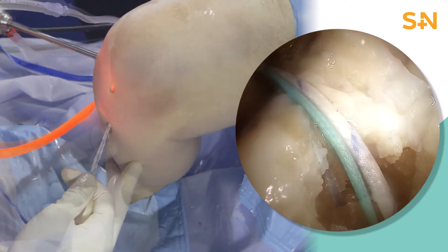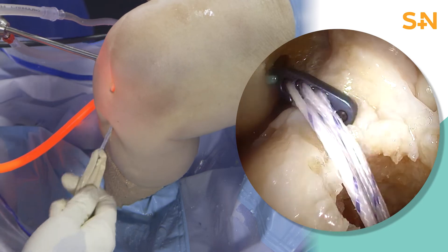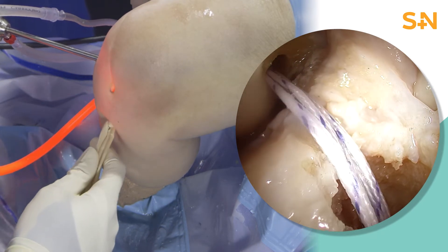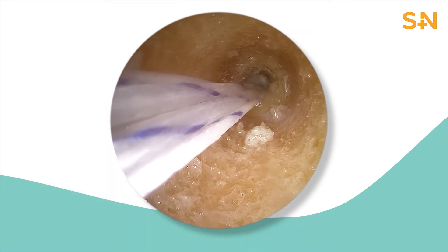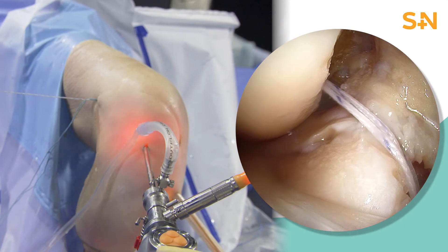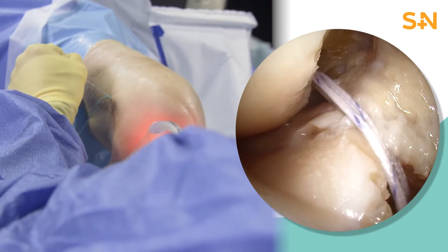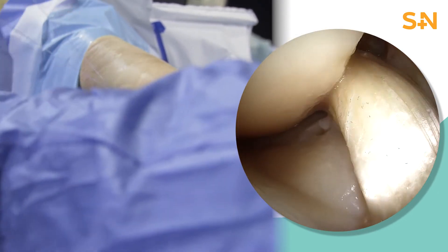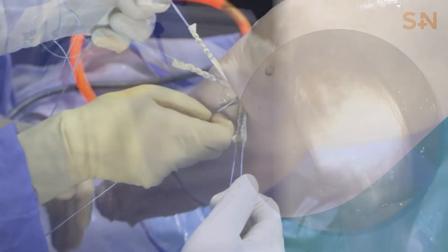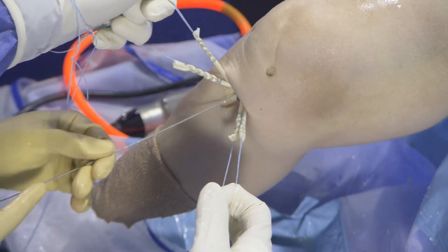The prepared graft and the ultra button construct is marked to know when to flip the button and to ensure that it lays between the cortex and the IT band. The adjustable loop allows us to reduce the graft into place without any assistance by pulling on the looped co-braid suture with one hand and providing counter tension with the other. As you can see, the graft is reduced into place. On average, a 25 mm length by the diameter of the tunnel is used.